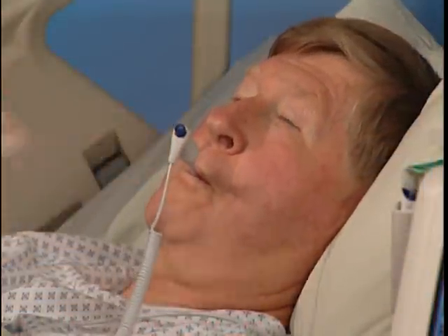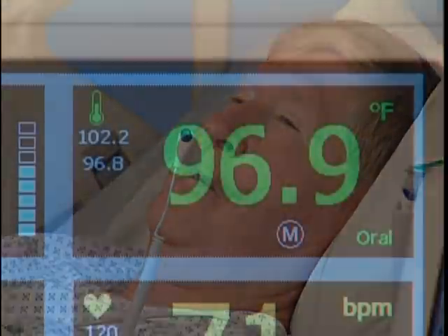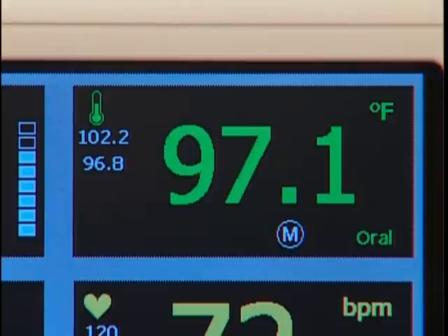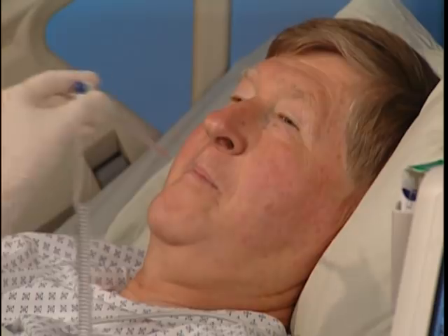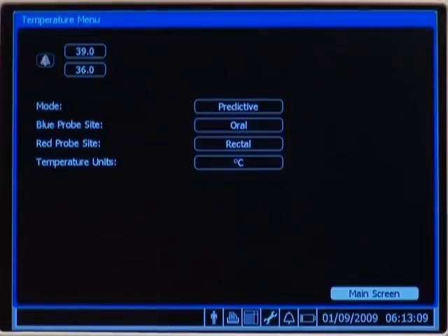In monitored mode, the monitor measures the patient's temperature continuously and displays the temperature in the numeric pane as long as the probe is in contact with the patient. It is recommended that the probe not stay in the mouth for more than 3 minutes. Highlight and select the temperature numeric pane to make changes to the high and low alarm limits, change probe site, switch between predictive and monitoring modes, and change temperature units.